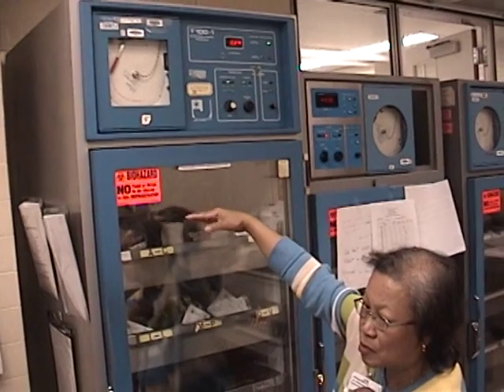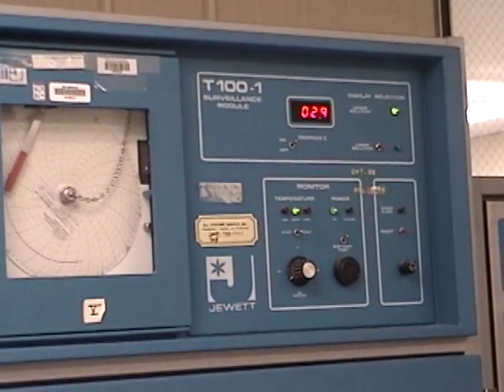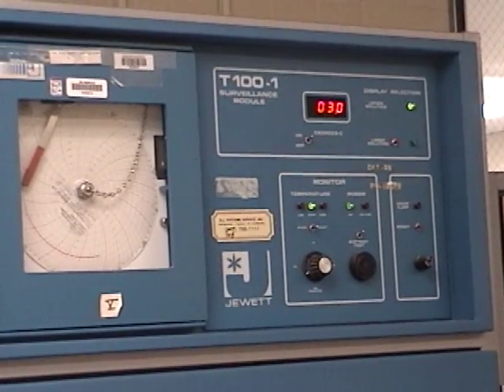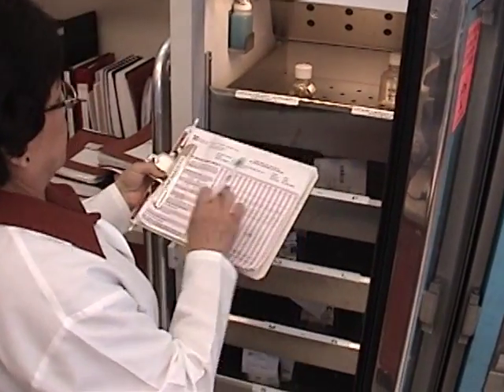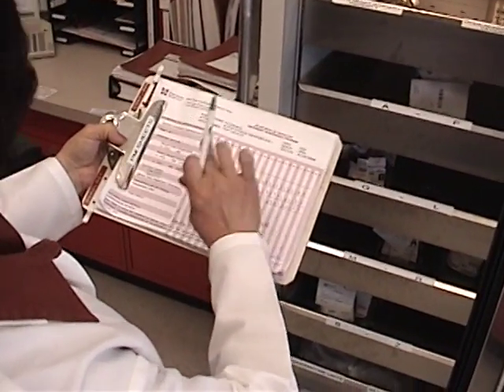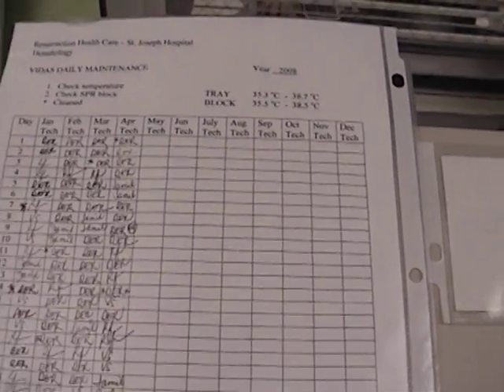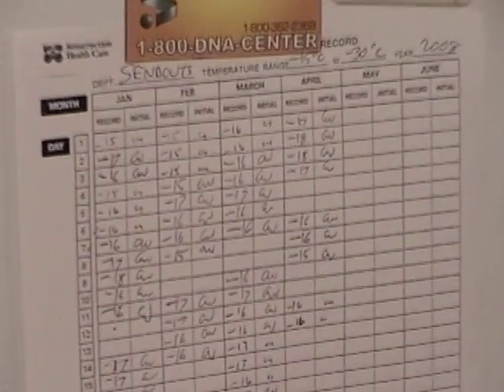Some equipment comes with built-in monitoring equipment, such as this chart recorder. Such chart recorders, however, have a maximum life of recording of up to 7 days, also requiring manual checking. In visiting these 2 hospital sites, it was clear that the technicians, although accustomed to their current recording methods, expressed room for workflow improvements. In one of the 2 hospital sites, a minimum of 5 people were required to assist with this manual process, where each would read the thermometer and record the temperature on a chart.